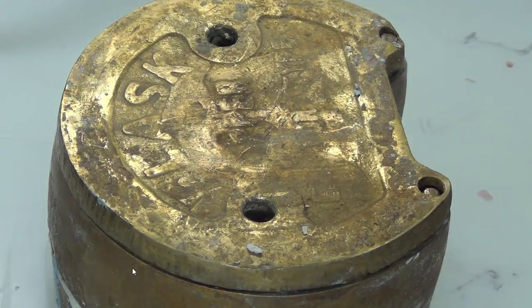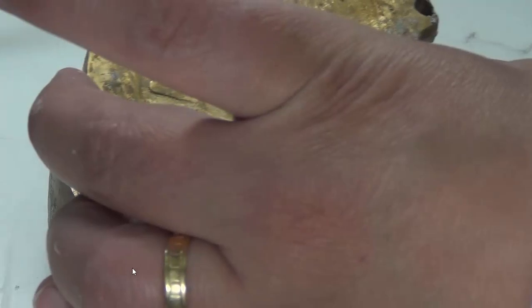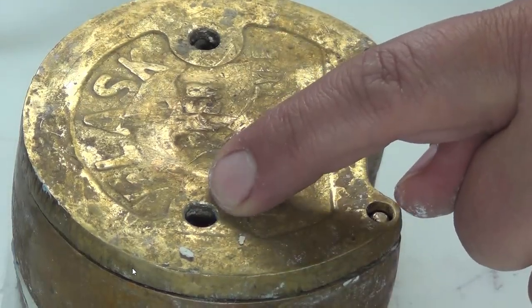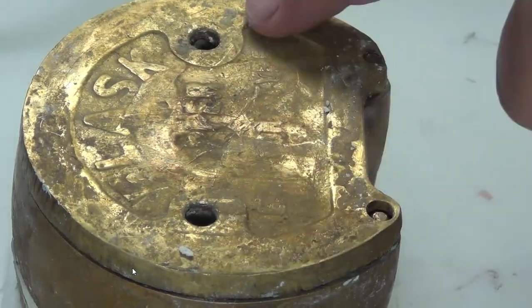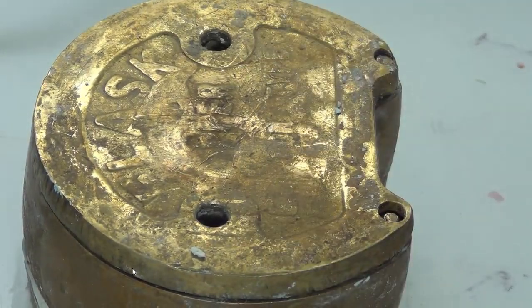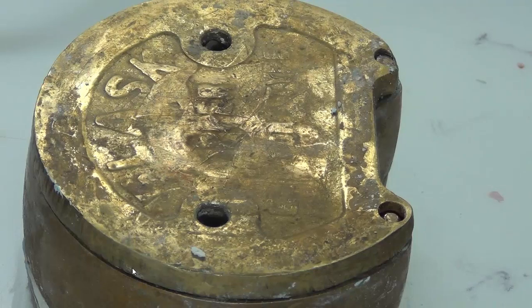filled in the flask, because any empty space in the flask, under the packing pressure, will move, the layers will move. We don't want to have any movement between the layers and the metal member. So we overfill it with the improved mix under the vibrating table vibration. And once you put the cover on, you will see the stone going out of these vents. So the excess stone will be escaping from these holes. So you will make sure that the improved stone inside is exactly covering all the layers and all the empty spaces in the flask. You may begin doing this step now.